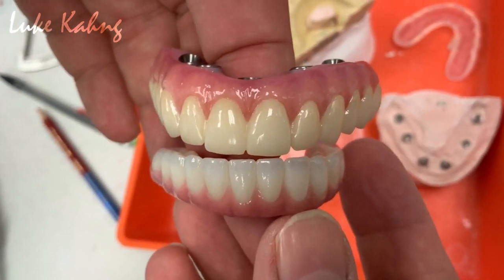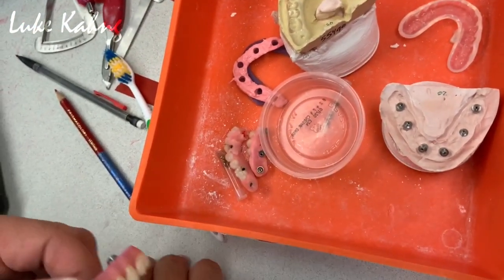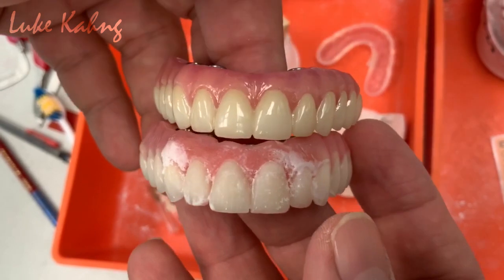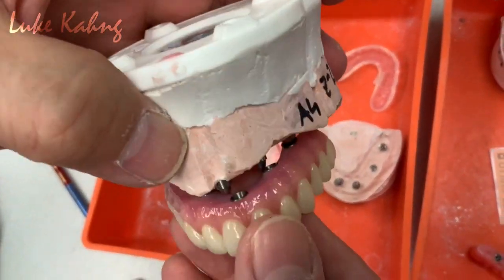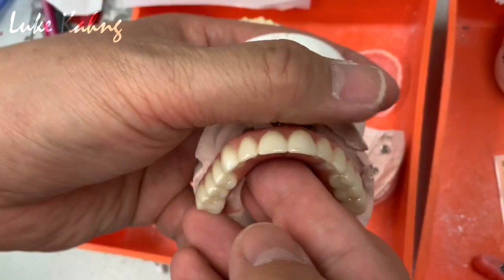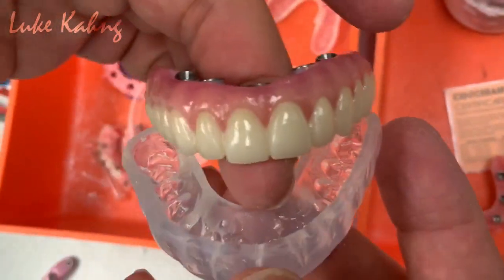Alright, two different cases. The one is the A1, which is mono, solid mono, no translucency. As doctor said, this one has some translucency, Saiten 4500. So, here is their guide. We're trying to mimic as close as possible, and make the great aesthetics, tissue contour, and then we cement this really good, like that. Alright, and we give them this one as well, so I can get the beautiful cases back.